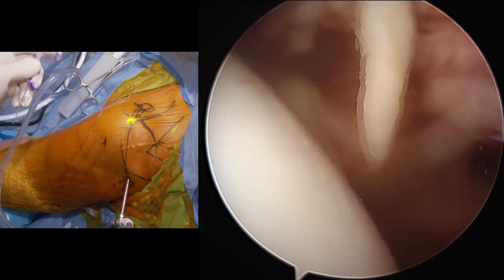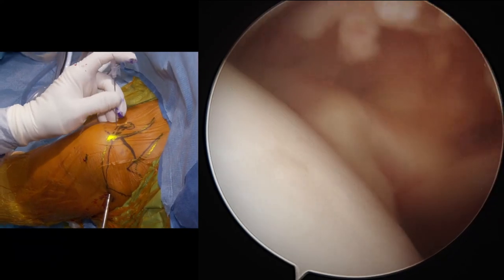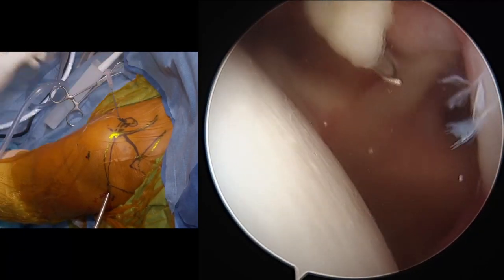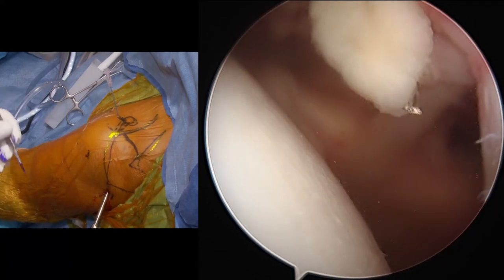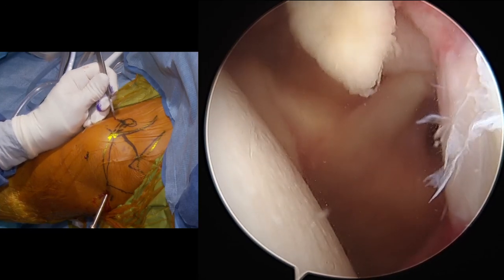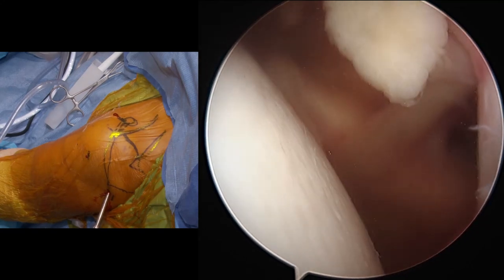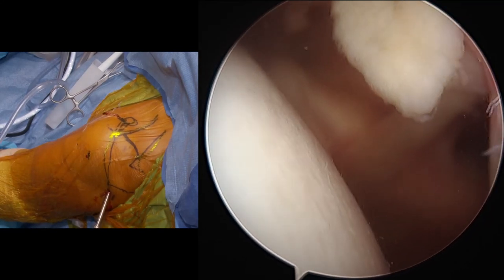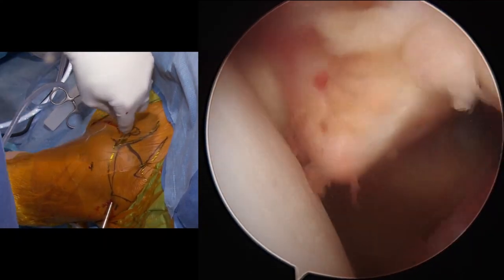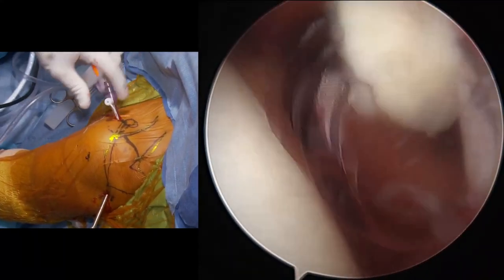So just off the edge of the coracoid, we'll establish our first portal through the rotator interval. We'll look for that needle up front, knife. Go ahead and take our cannula. Do we just have big cannulas up? Let's use the smaller one if we have it for now. Thank you, that's good. And we'll establish our anterior portal. Then we'll take the shaver and start to clean up the joint.